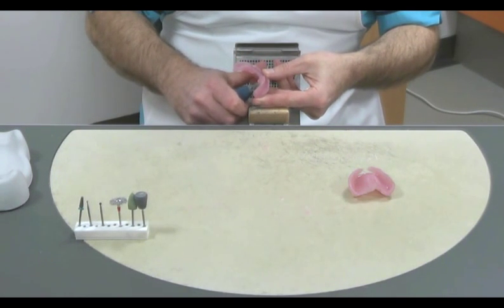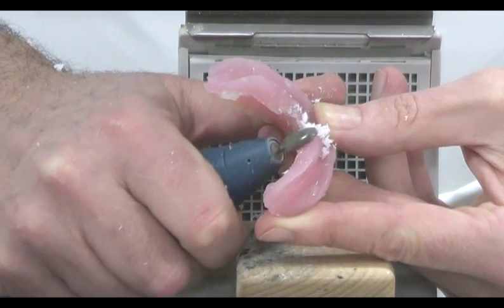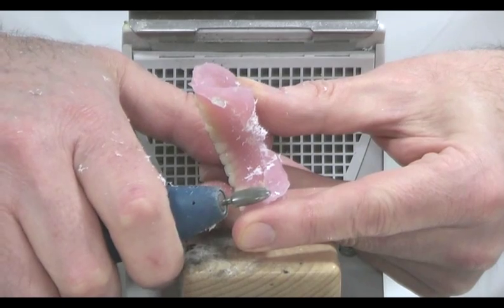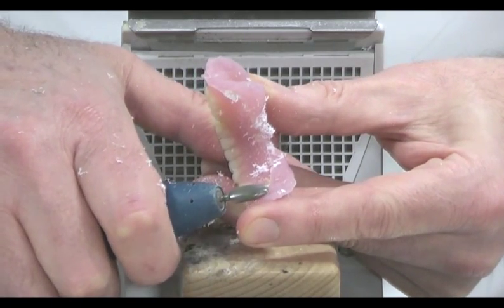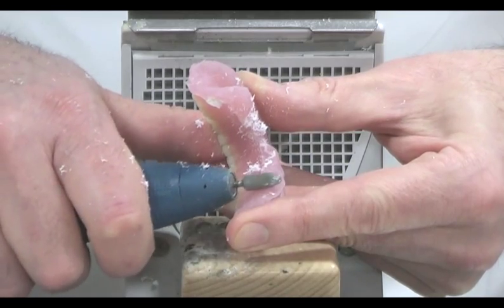We now trim off the excess acrylic using a variety of different abrasives, starting with a tungsten carbide burr. First of all, we remove the excess that has been pushed out between the two halves of the flask. We call this the flash.